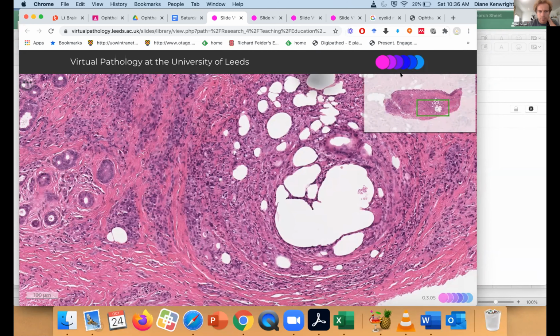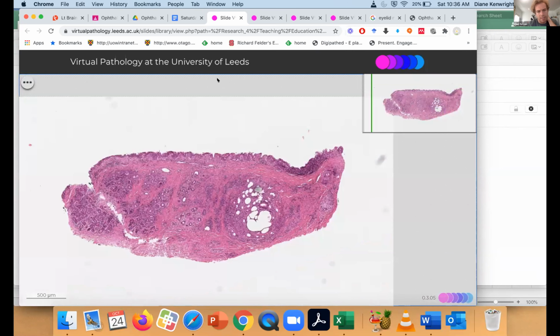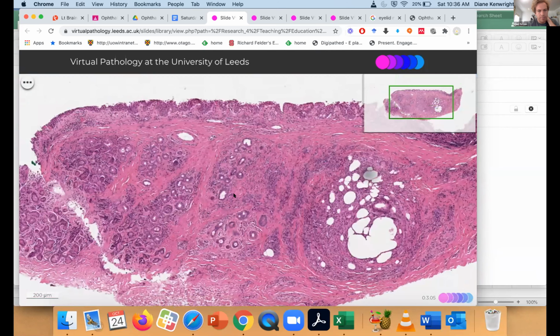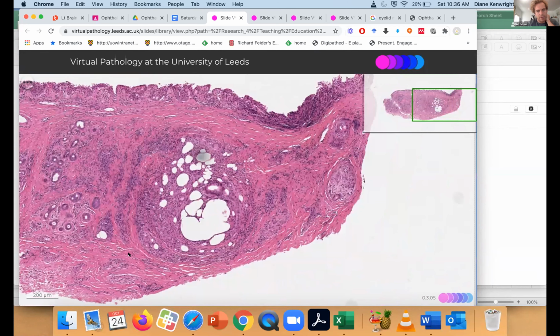We'll go, Diane, on the image that you're in now. Obviously, if you just zoom out a little bit, is that obviously the fat and the glandular structure, and then just on the outside of that, we were looking at some cells. Can you just confirm what type of cells they are? Just kind of around the edge of that chalazion, just to the left of it.